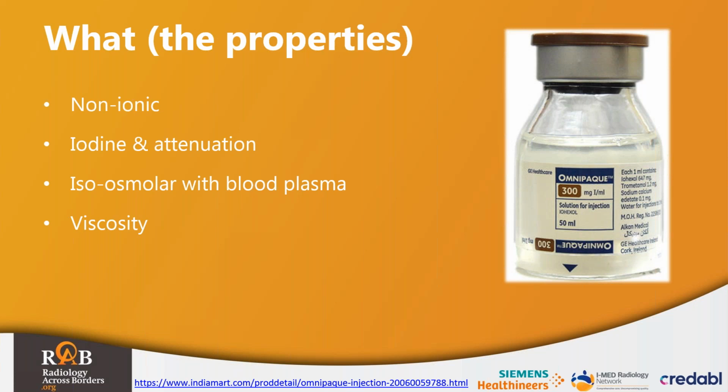It's also roughly isoosmolar with blood plasma, which means essentially the same osmotic concentration. Therefore, it doesn't exert any osmotic forces on the body. Again, anyone that's worked with contrast understands it's quite a viscous fluid, so basically thick and sticky.